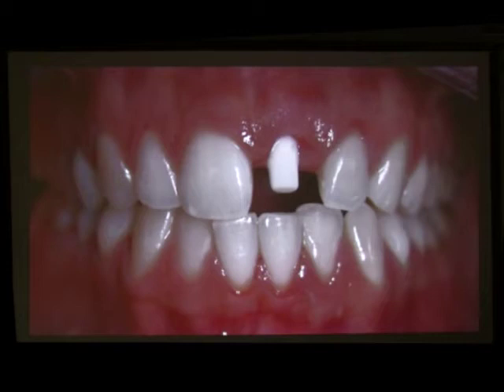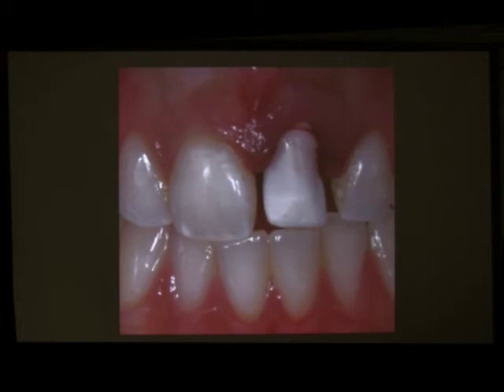Sorry that I interrupt you. I have a question. When you make the impression from the implant, with your pre-conventional industrial copings, how does the coping fit on the abutment? Because you have no click mechanism? Exactly. This is a coping made of zirconia. It's not plastic, so it doesn't produce a click.